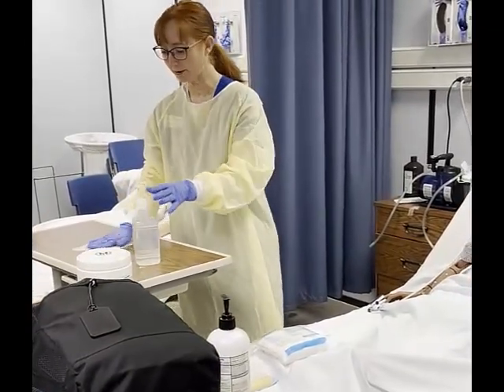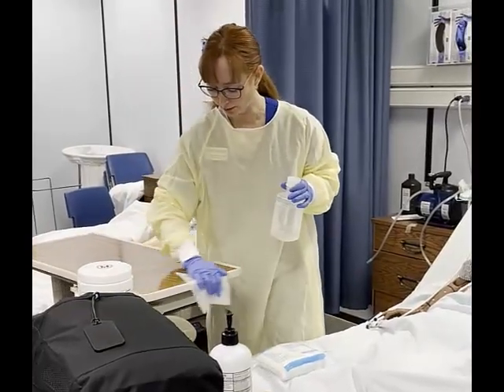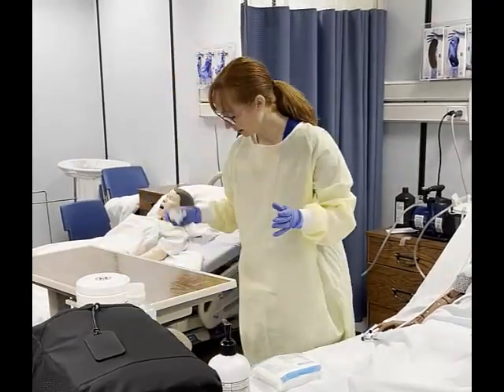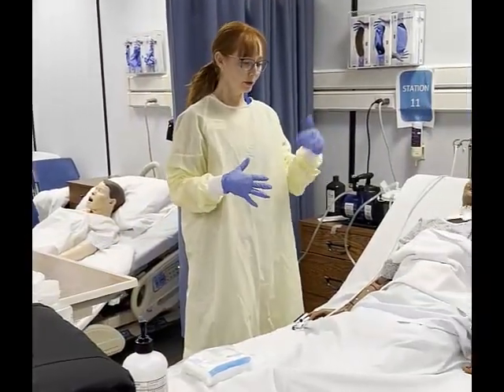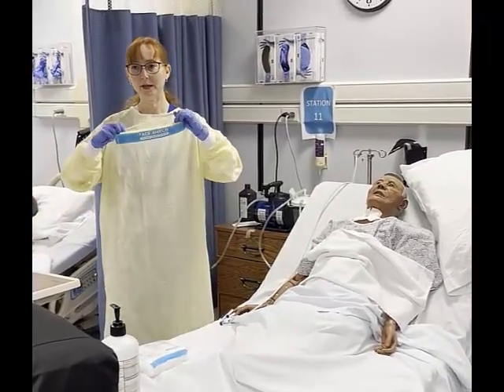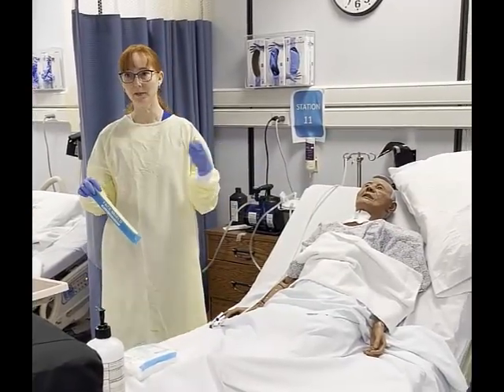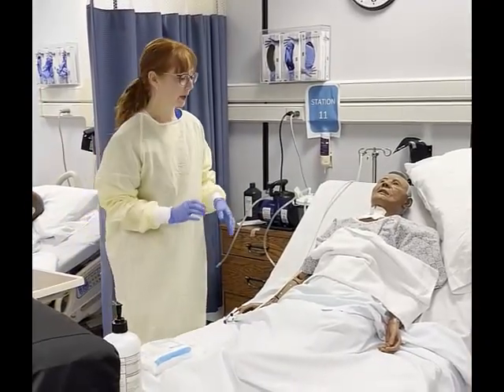If we need to use half-strength hydrogen peroxide, do you guys know how to make a half-strength solution? I'll show you today. When you're doing tracheostomy care, it's a good idea to have your PPE on, including your face shield. I may not put mine on just so you can hear me better, but you would have a face shield on to protect you, because this patient may be coughing and there may be sputum or mucus coming out.